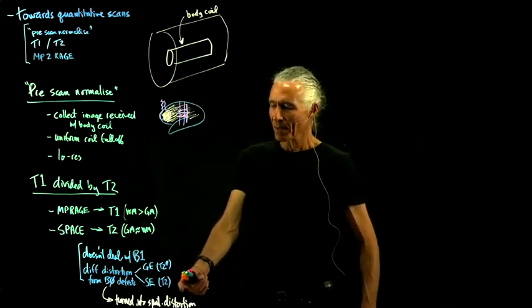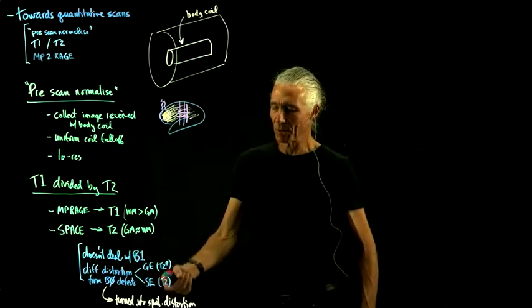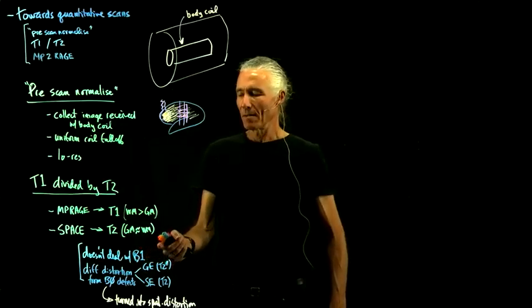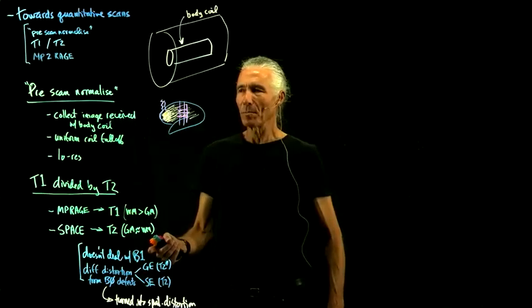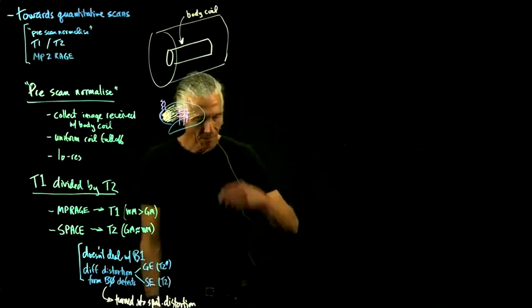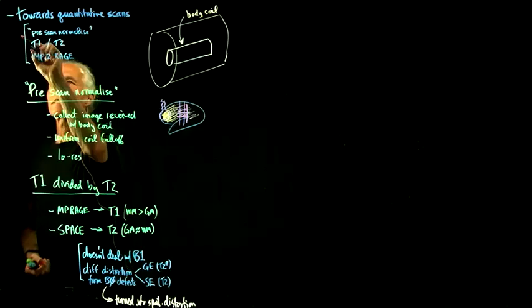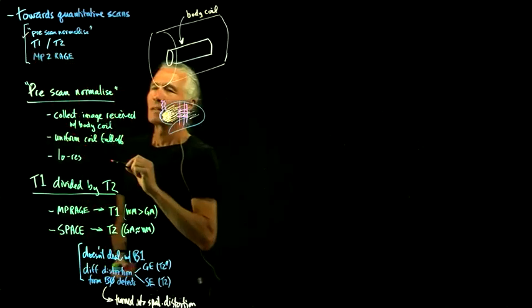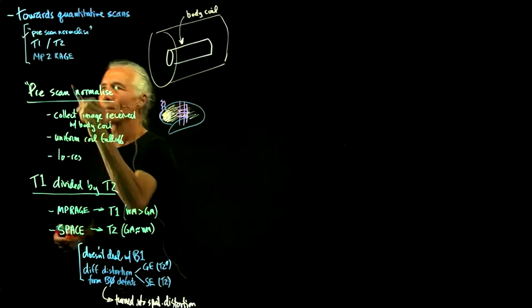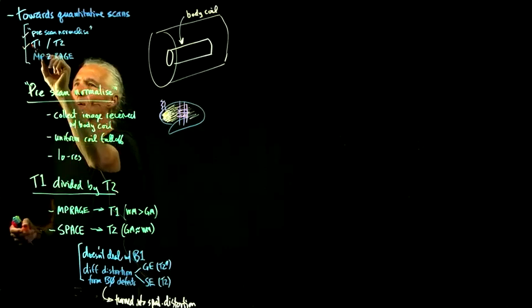to essentially collect scans of all the same kind, so you don't have this spatial distortion difference, and then also try to estimate what the actual local B1 is, and factor that whole thing in. Okay, so that was collecting quick and dirty scans through the body coil in order to normalize the brightness, or collect a whole other scan, and divide by it.